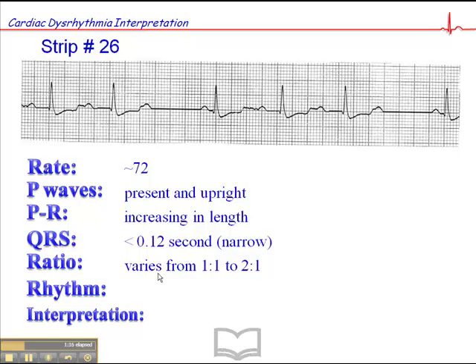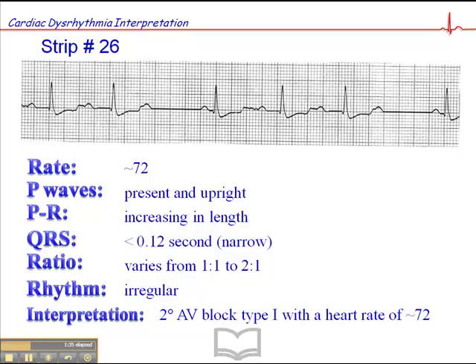That's also consistent with a specific dysrhythmia, and the rhythm is irregular. So if you haven't already figured it out, when we have an increasing PR interval length where there are dropped beats, and sometimes we have a 2 to 1 ratio, and the rhythm is irregular, this is a 2nd degree AV block type 1, also known as Wenckebach, with a heart rate of approximately 72 beats per minute.